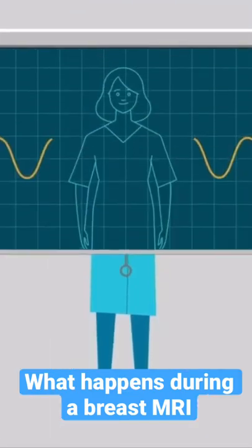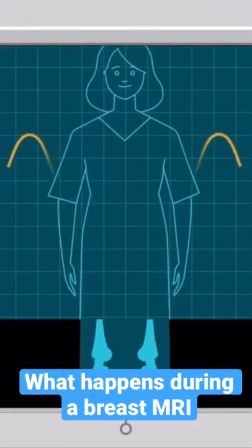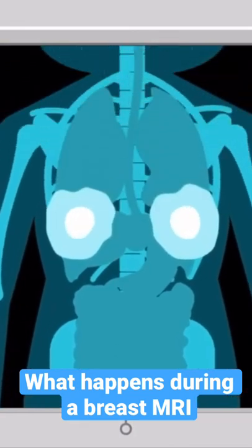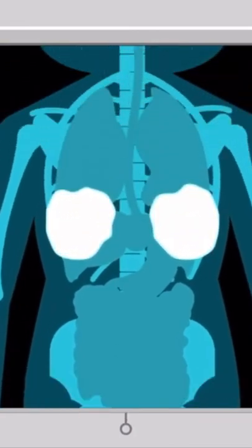A breast MRI uses a strong magnet to take detailed images of your breast tissue. We inject an IV contrast to help us see the images more clearly. An appointment takes about an hour, but the actual scan only takes about 15 minutes.